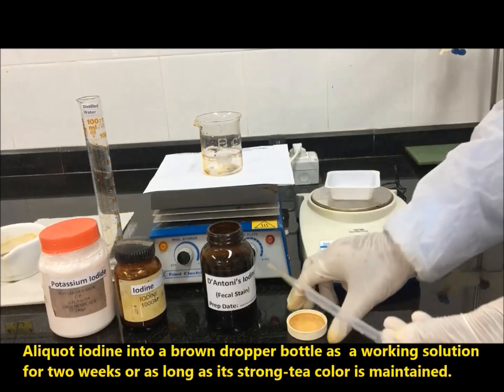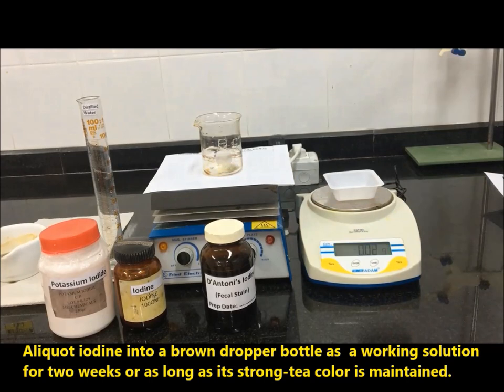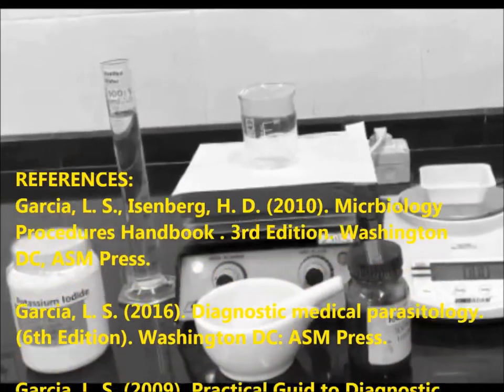Aliquot iodine into a brown dropper bottle as a working solution, good for two weeks, or as long as its strong tea colour is maintained.